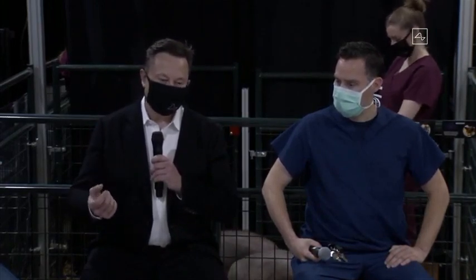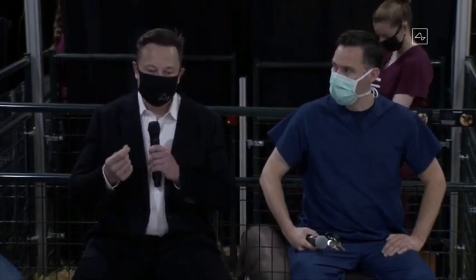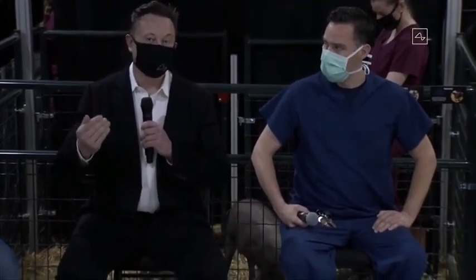And I think something that's very exciting as a long-term application is if you can sense what somebody's trying to do with their limbs, then you can do a second implant at the base of the spine or wherever, just after wherever the spinal injury occurred, and you can create a neural shunt. So I'm confident that long-term it will be possible to restore somebody's full body motion. So if somebody even has a severed spine, they will be able to walk again. They will be able to use their hands. When you have a severed spinal cord, you essentially have broken wires. And so if you can just jump over those wires and transmit the signals over them, you can give somebody the ability to walk again, naturally.